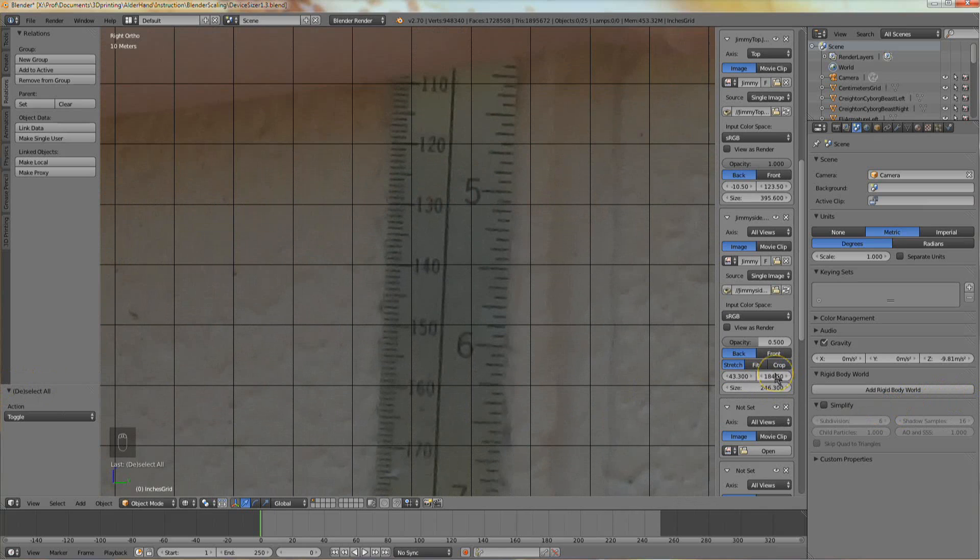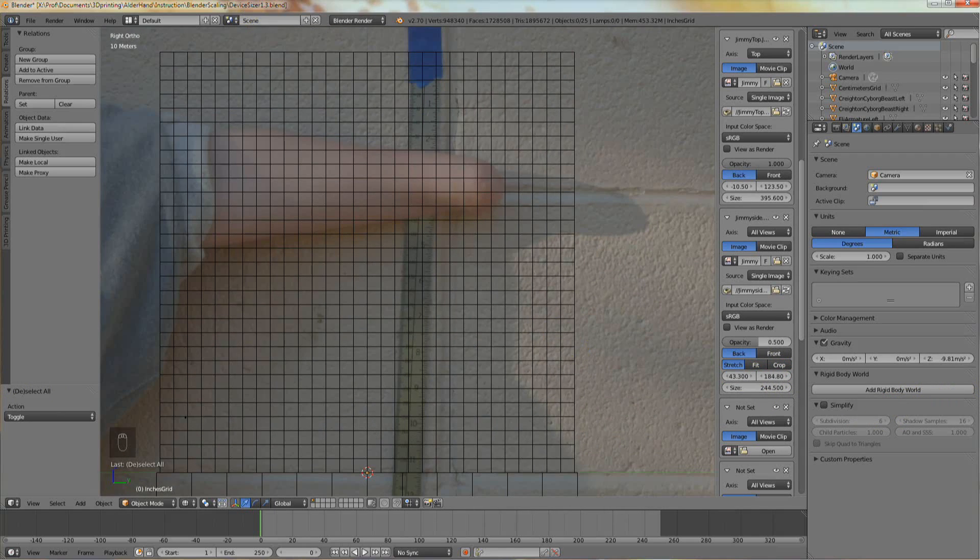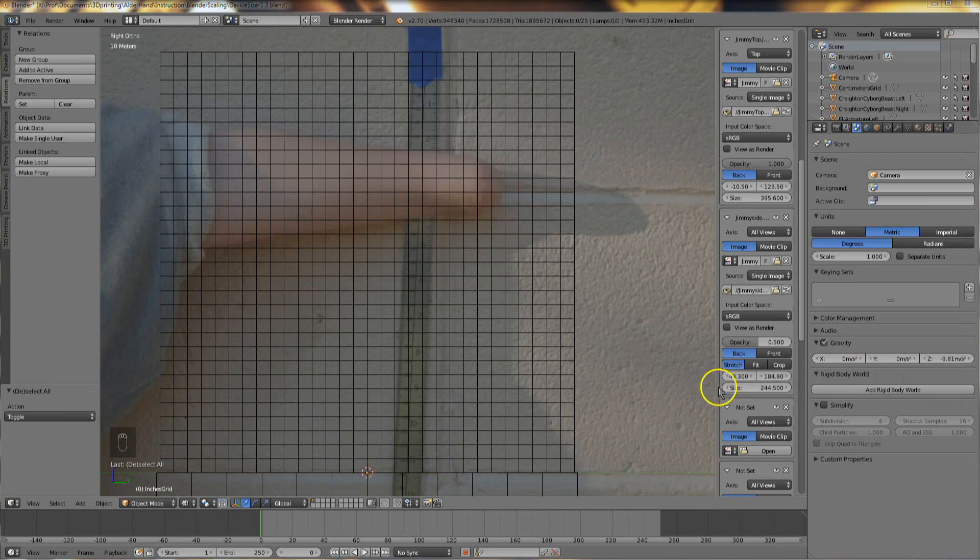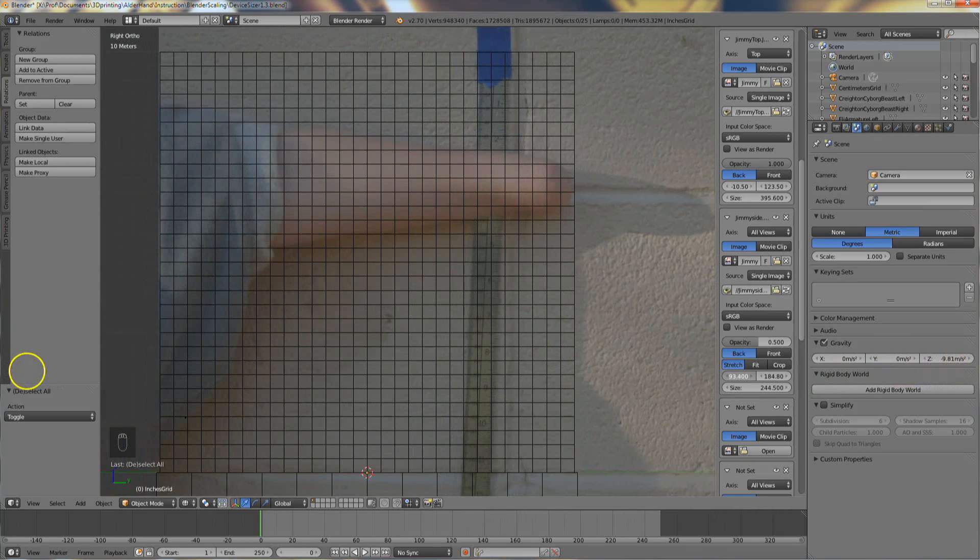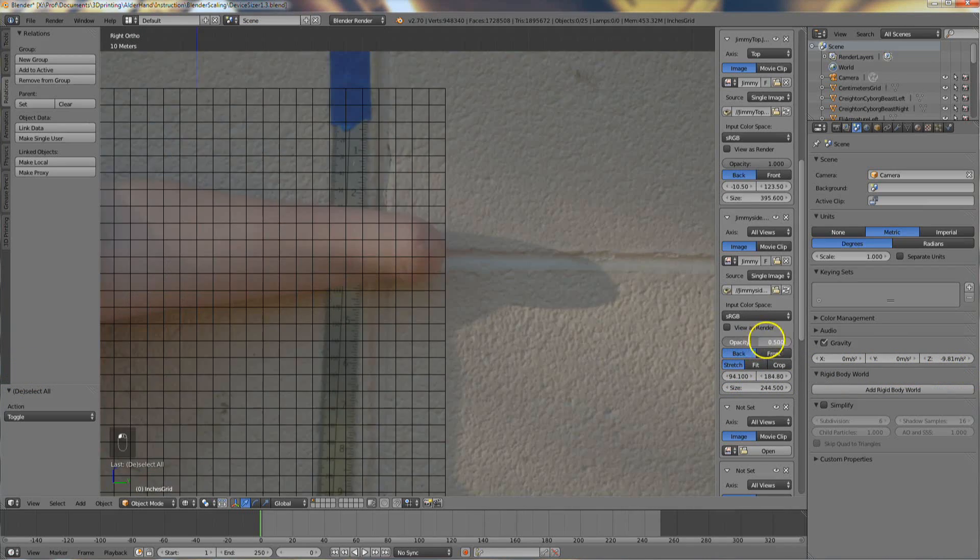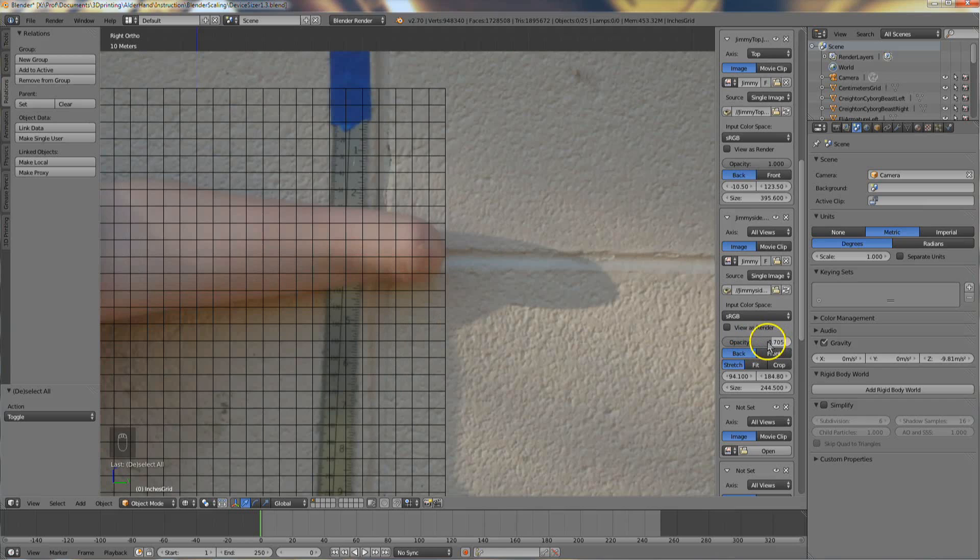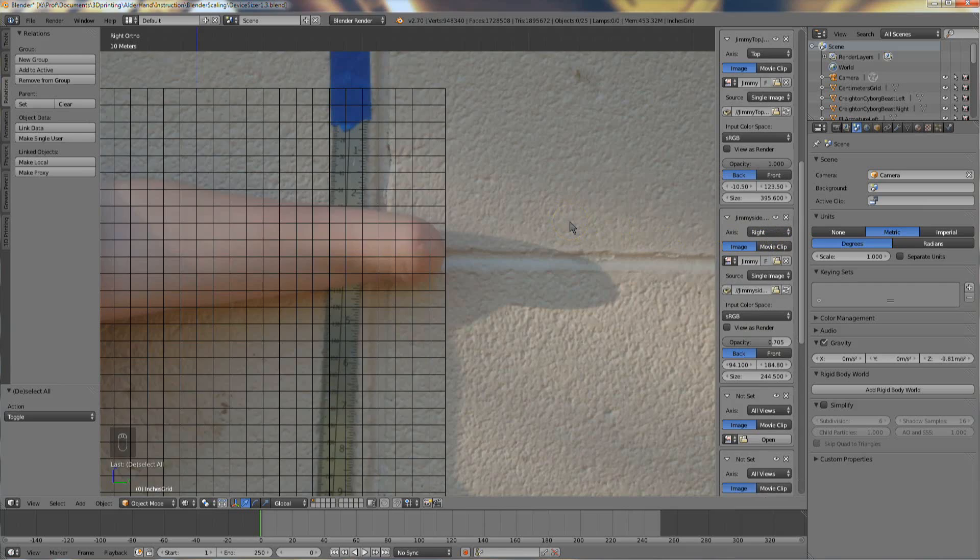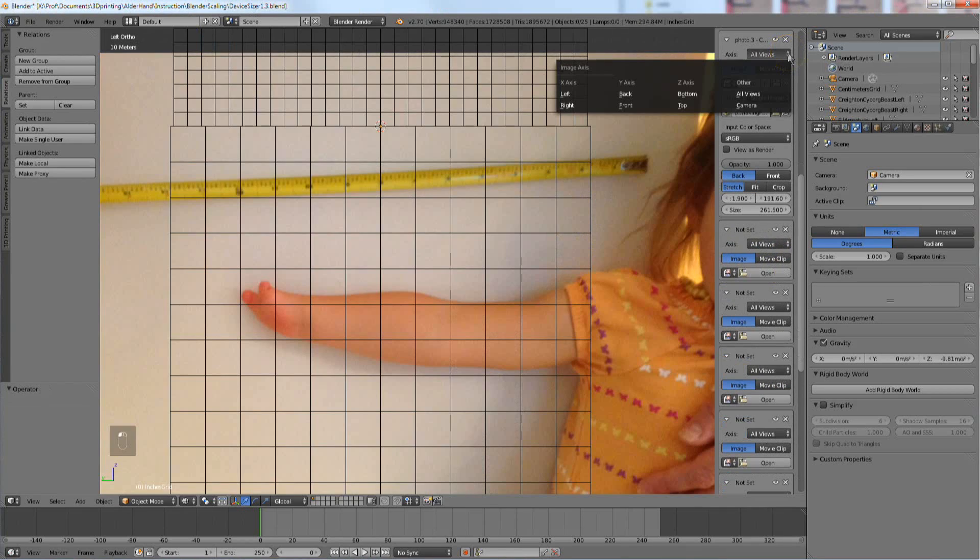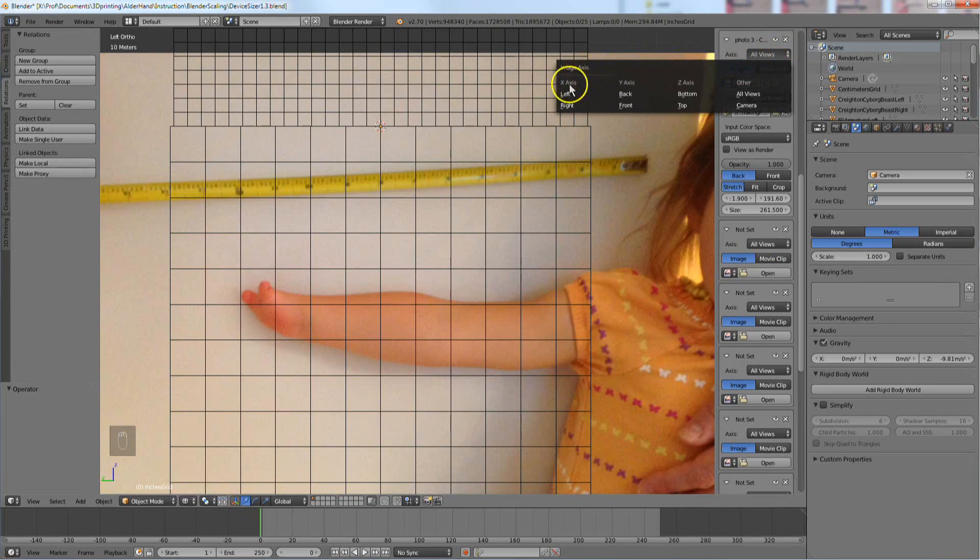Once the scale is correct, use the left right position control to make the client's distal edge reach the end of the grid. Finally, where it says axis, click on all views and change it to right for this client's left hand, or left if the photo is a right hand.